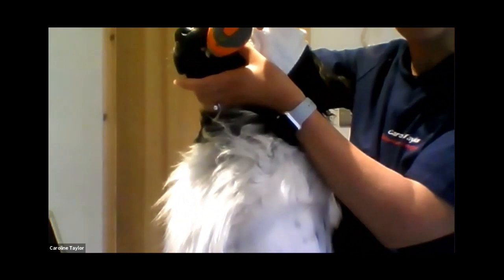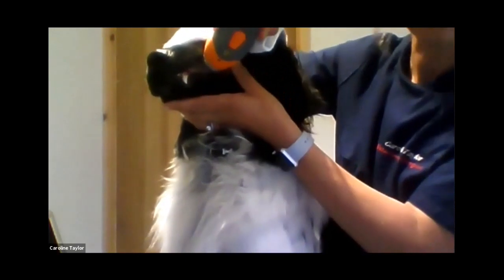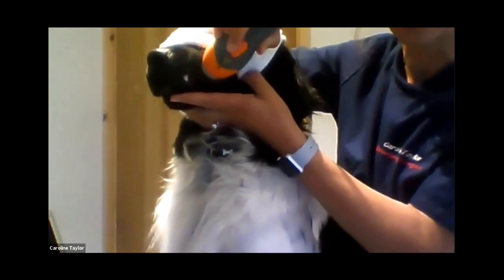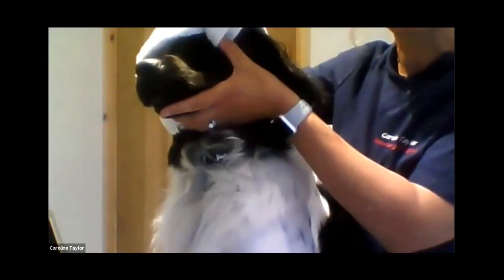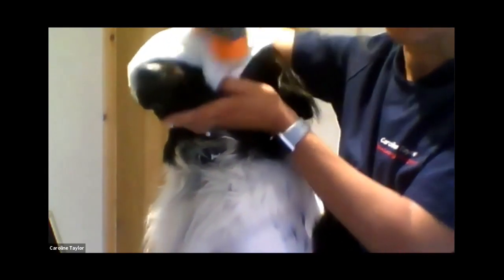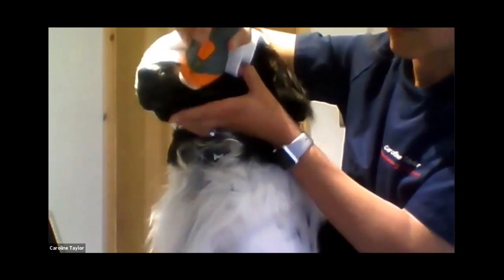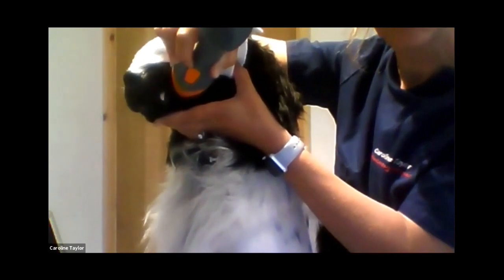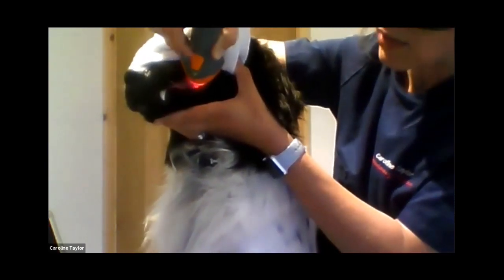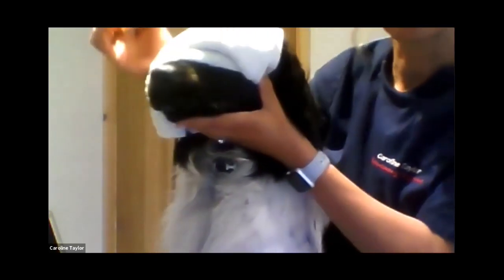If you're going directly onto the gum, then you can do that directly over a gum. Often, once they know it's not going to hurt, you press the button to start delivering laser, and if they move or the cover comes off the eye, you can just press that again and stop the laser straight away. So you can see the laser working. It won't do any harm even though he hasn't got inflammation. Right there over the gum. And that would be each point you'd be treating on that side and lower down.